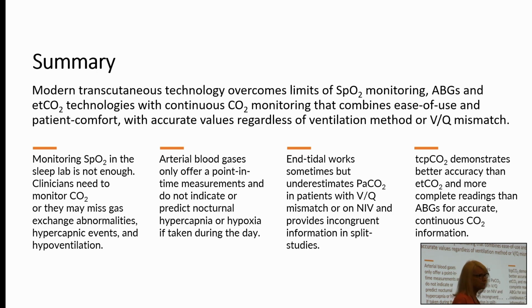The degree of warming is a lot less than we used to use. Some technology out there uses 42, 43, 44 degrees. Digital technology is going to use 41 or 42 degrees. So it's a slight warmth, but it's by no means hot. And those adverse skin effects that we used to see, we just don't see those anymore.